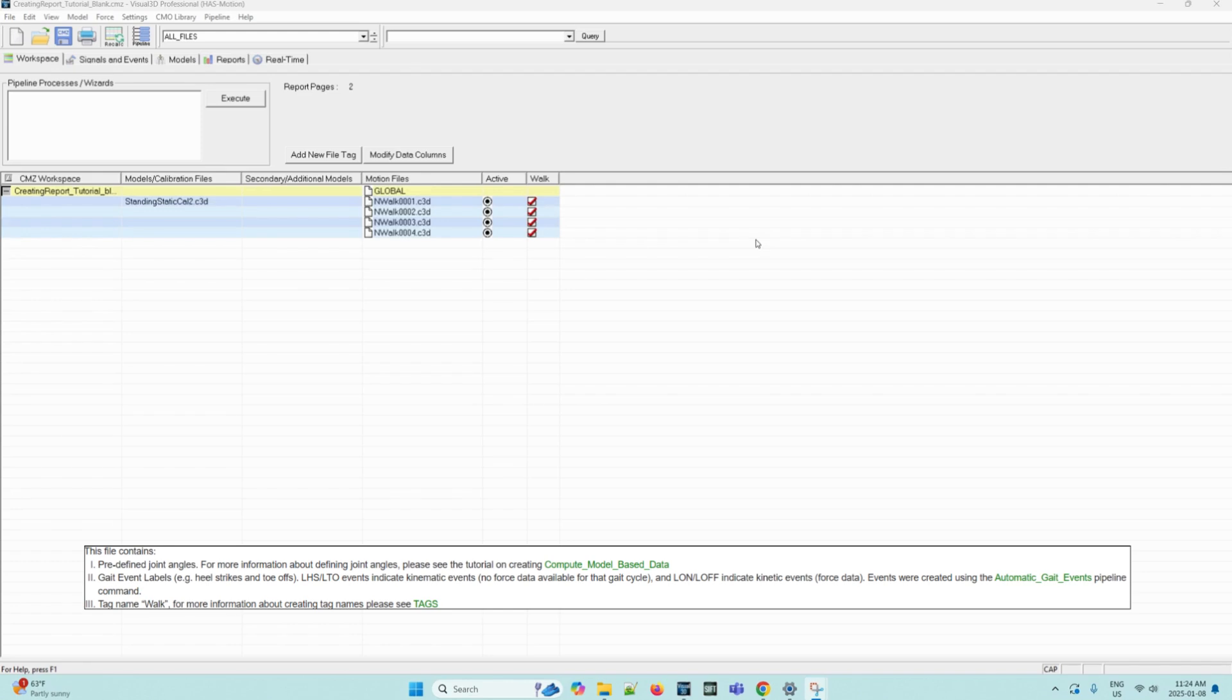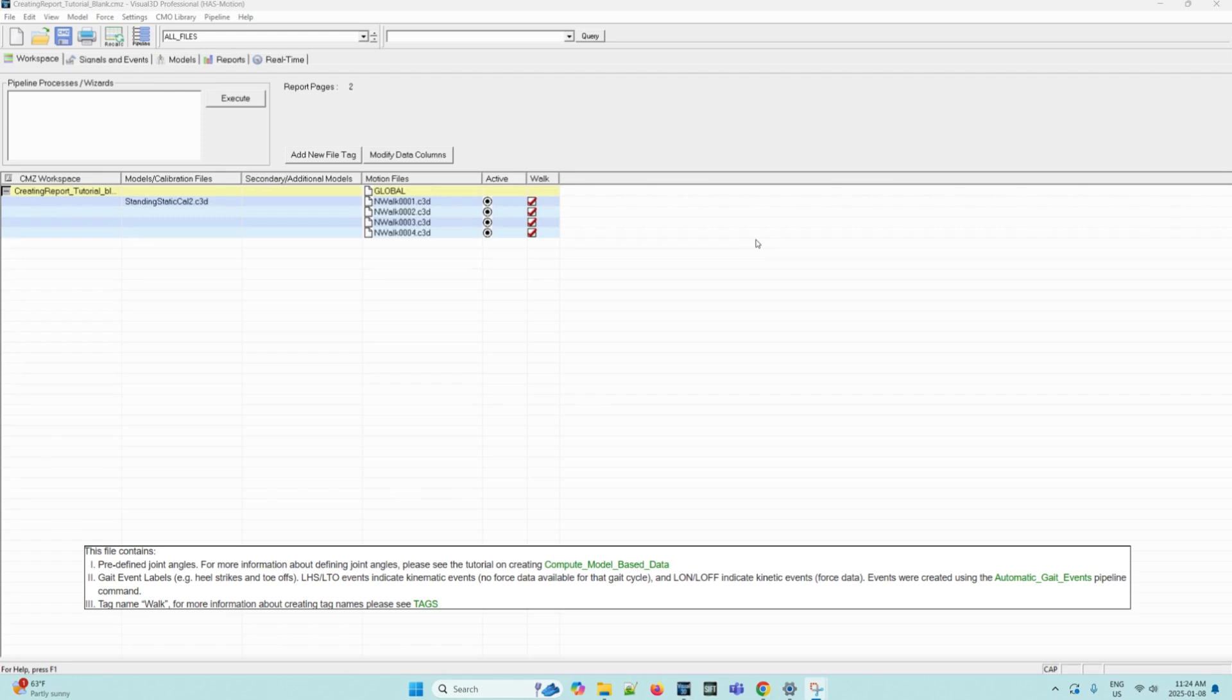Second is gait event labels, such as heel strikes and toe-offs. These specifically indicate kinematic events, meaning there is no force data available for that gait cycle. If it was an on/off label, this indicates kinetic events, meaning force data is available. These events were created using the automatic gait events pipeline command.